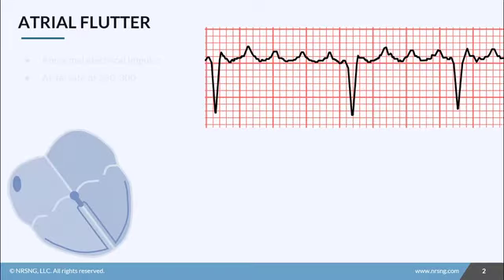About the characteristics of atrial flutter and how to identify it on an EKG. We're also going to talk about some of the complications, nursing interventions, and treatments for A-flutter.